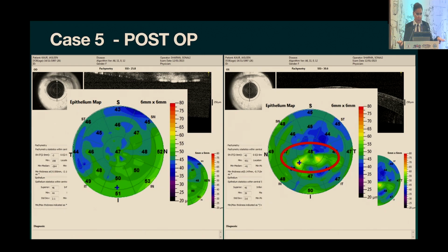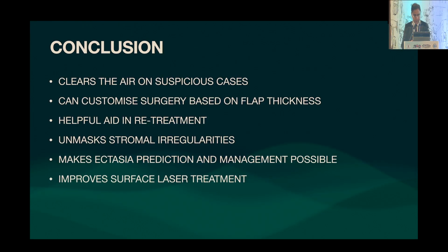When I've done a lenticule surgery, I'll finish in a second. I would like comments from all of you whether you have done this, seen this, or noted this, because I just realized why the patient was unhappy in one eye. You see the surface, everything is good. The area of the stroma is very smooth, no striae. We dilated, we checked on retroillumination, smooth, everything is fine. But the patient is unhappy with one eye. So this is just a thought and an observation which you can take up.